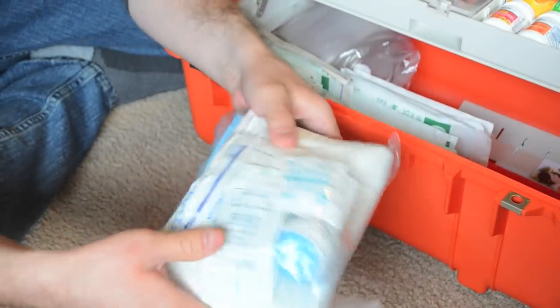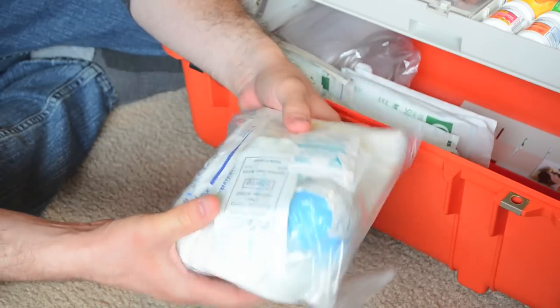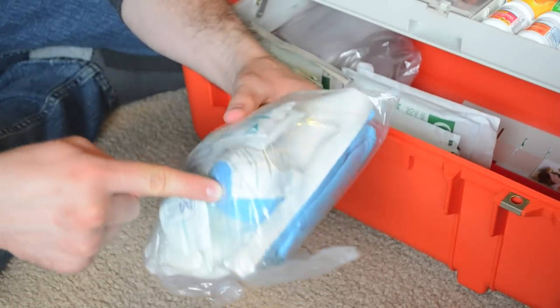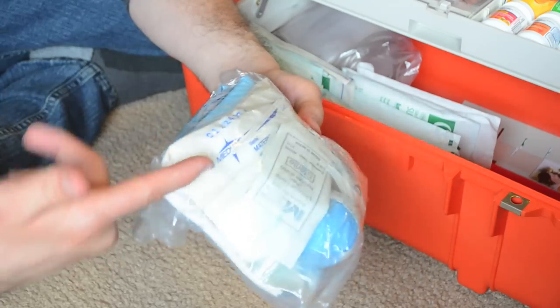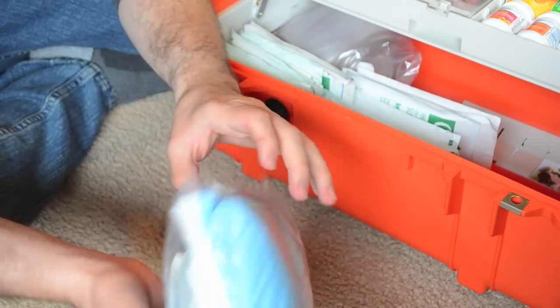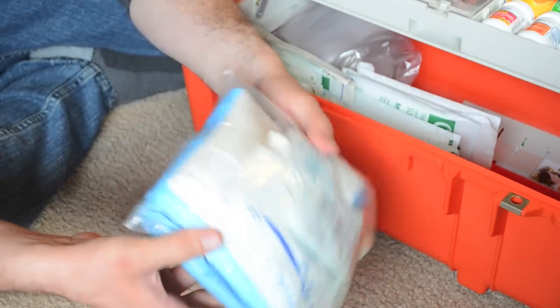Back here I have an OB kit. I keep this in here just in case because my wife is pregnant. In here there's a bulb syringe, a scalpel to cut the umbilical cord, some clamps to clamp off the cord, some chucks pads and things like that. It's a very, very basic kit. There are also some sterile gloves in here.